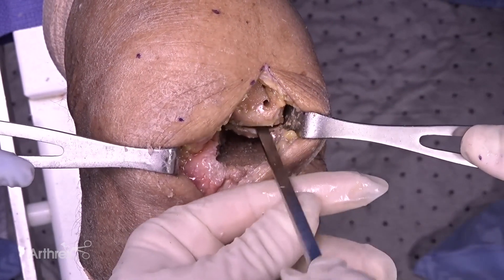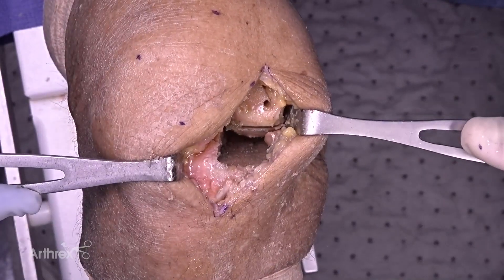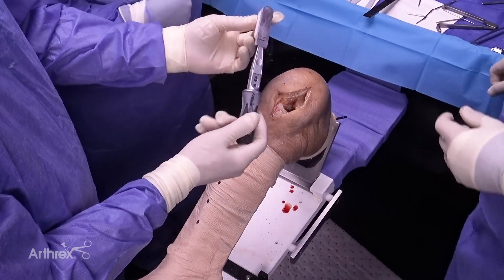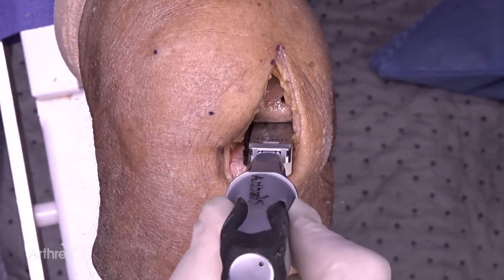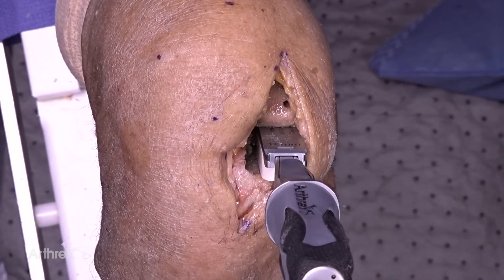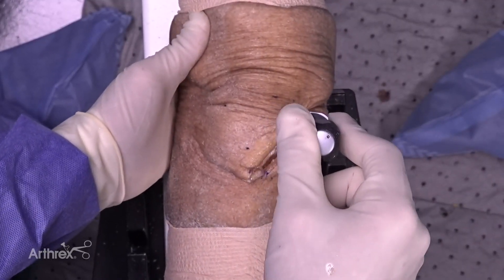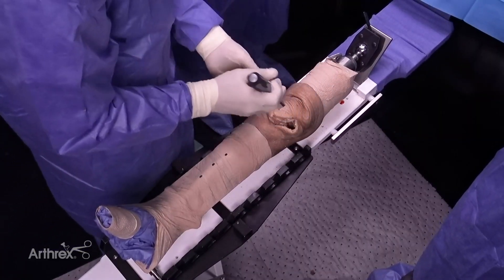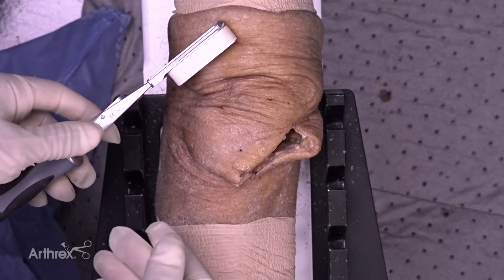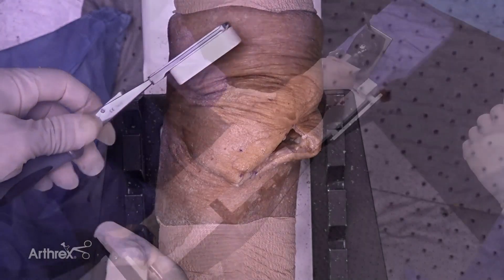Now we have very nice visualization. The cut's almost completed — there's just a little lateral bridge of bone I will finish with the saw. Here's an 18mm static spacer block, and it fits absolutely perfectly with perfect tension. So our flexion space has been set. We check our extension gap and the block fits in perfectly. I no longer do this step because it is so reproducible — if you have a fixed space and cut a fixed amount, it's going to be that total amount every time.